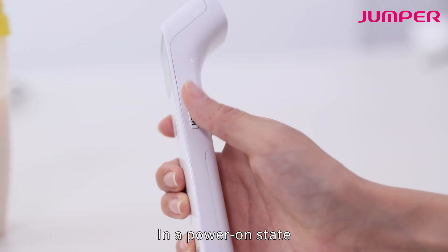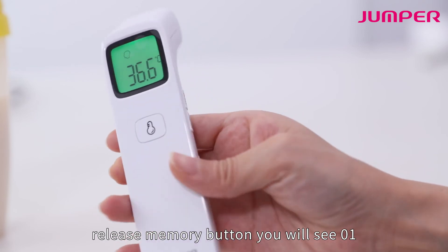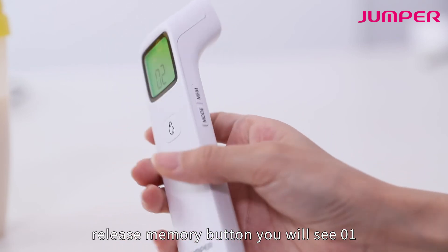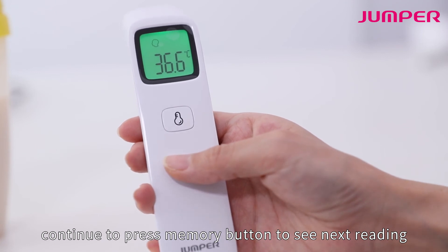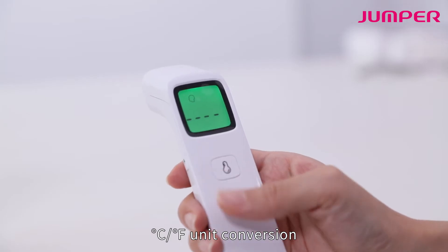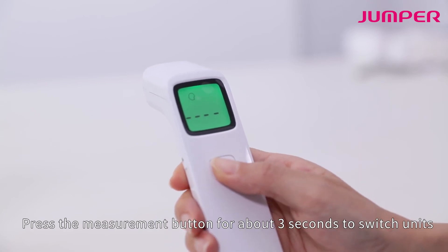In a power-on state, press and hold the memory button — you will see "01". Continue to press the memory button to see the next reading. For C/F unit conversion, in a power-on state, press and hold the measurement button.